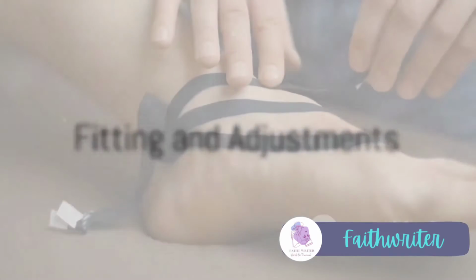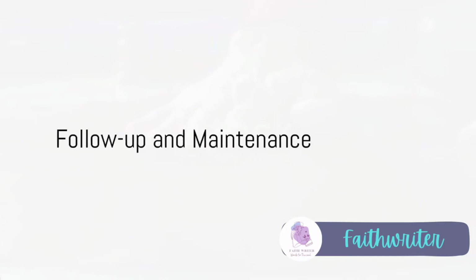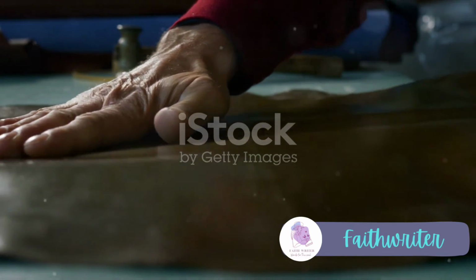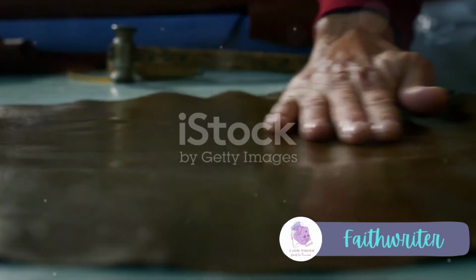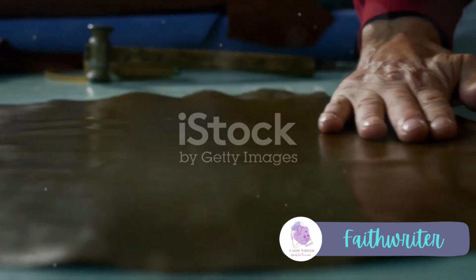After manufacturing, the AFO is fitted to the patient. The orthotist ensures that it fits properly and makes any necessary adjustments to optimize comfort and function. Patients may require follow-up appointments for further adjustments and to ensure that the AFO continues to provide the necessary support. Maintenance and repairs are also part of long-term care, ensuring the device remains functional and comfortable.